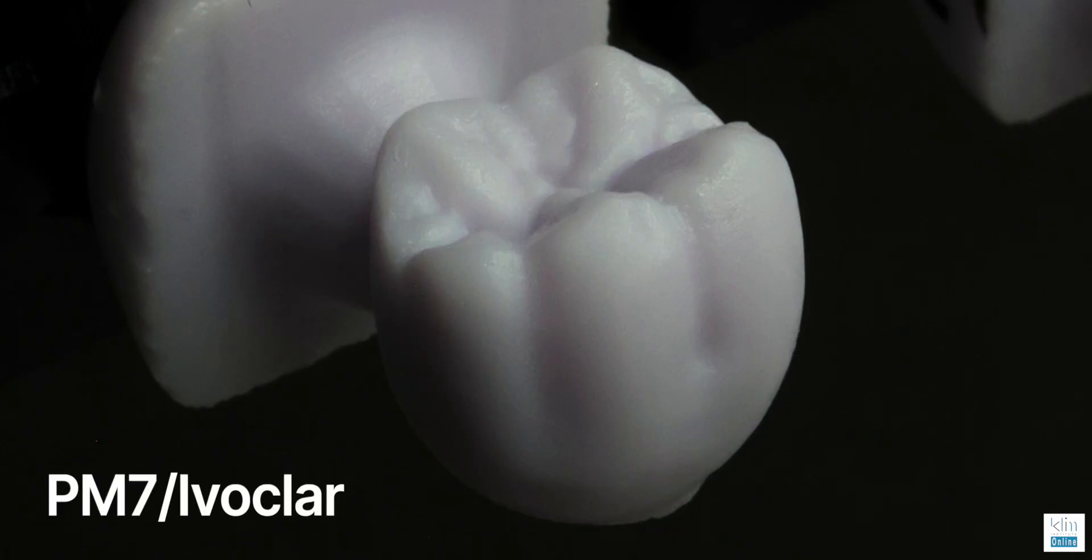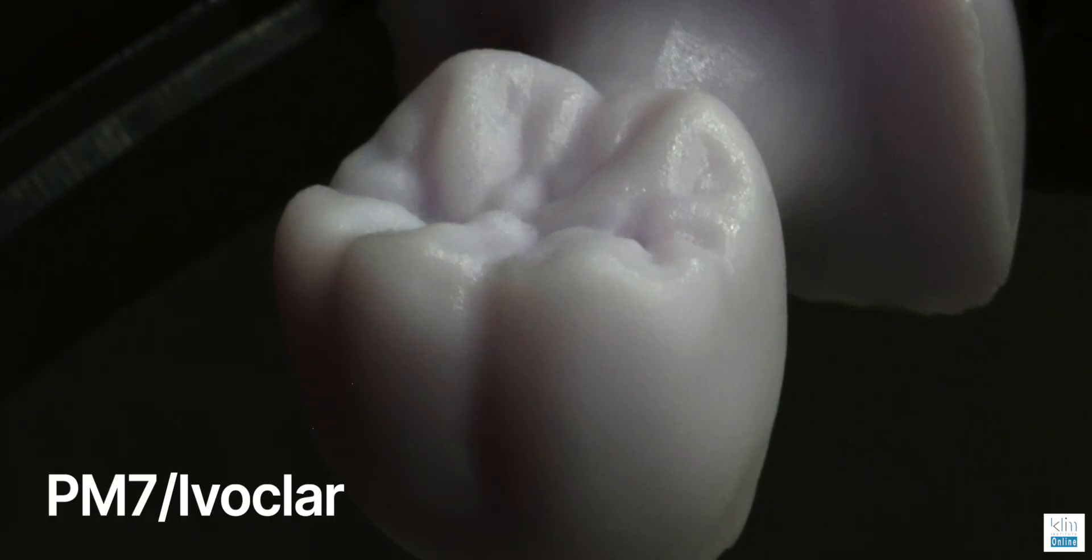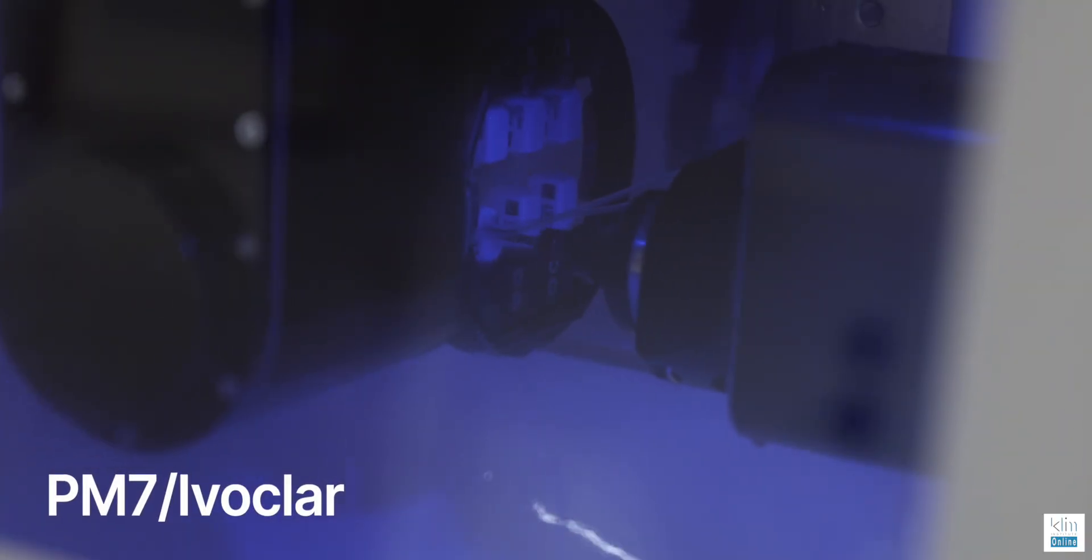One more thing on shaping. When I'm using a five-axis with fine mill, you can see all that occlusal anatomy is really refined, but that takes 41 minutes. If I'm using my prime mill on extra fine, that takes about 13 minutes for this restoration. I still refine the occlusal table, but there's not a lot to do. You have to weigh the time. The five-axis, in this case I'm using the PM7, it's probably not a one-appointment restoration. I vacillate between the two based on whether I'm trying to deliver this in the same day or not.